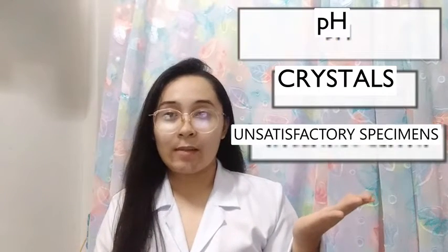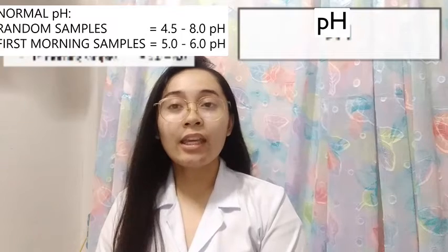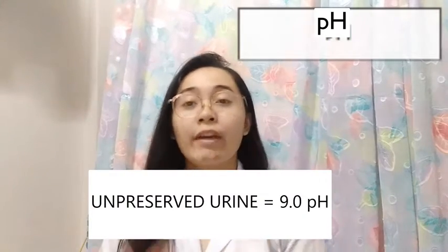pH. This test is primarily an aid in determining the existence of systemic acid-base disorders of metabolic or respiratory origin, in the management of urinary conditions that require the urine to be maintained at a specific pH, and also in the identification of crystals and determination of unsatisfactory specimens. Normal random samples of healthy individuals range from 4.5 to 8.0 pH, while in healthy individuals' first morning samples, the pH range is 5.0 to 6.0. However, unpreserved urine has a pH of 9.0, which is very basic.